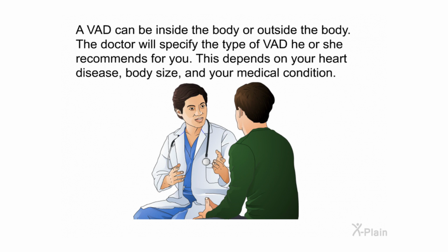A VAD can be inside the body or outside the body. The doctor will specify the type of VAD he or she recommends for you. This depends on your heart disease, body size, and your medical condition.